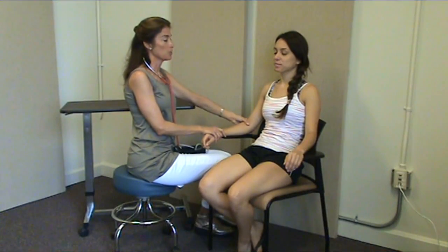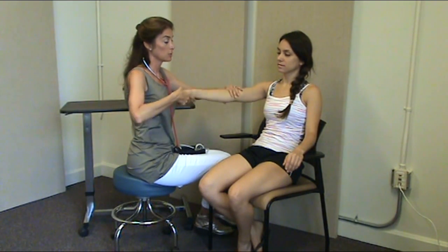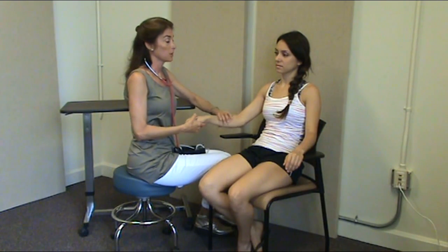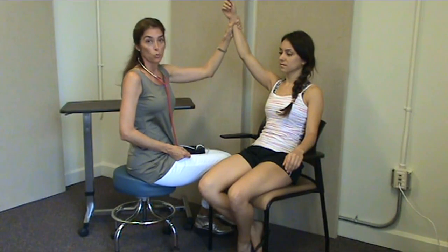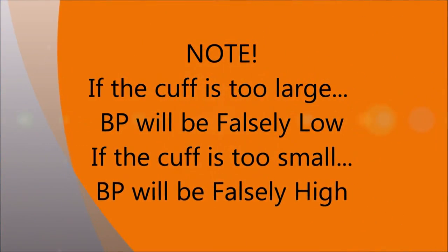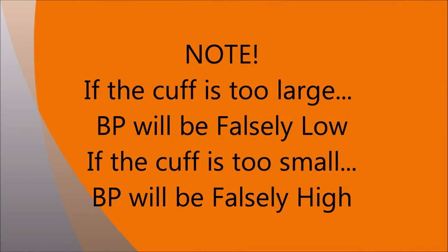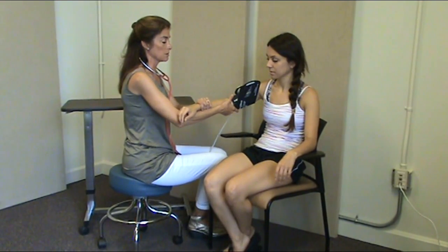So when taking a blood pressure, you want to make sure that the arm is at the same level as the heart. If it is below the heart, you can get a falsely elevated blood pressure, and if it is above the heart, you will get a falsely low blood pressure. So you want to make sure that you are supporting their arm.